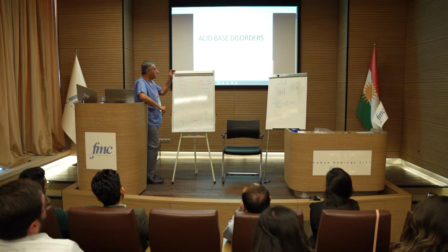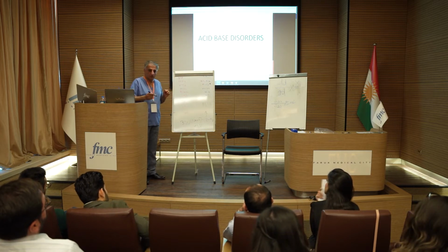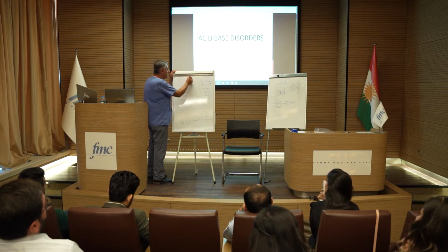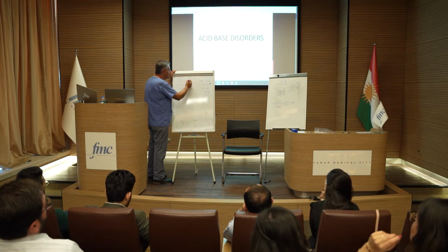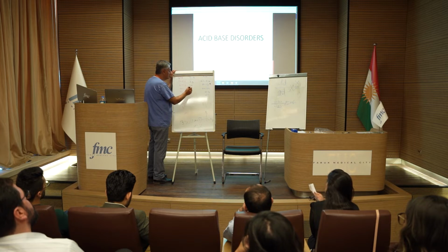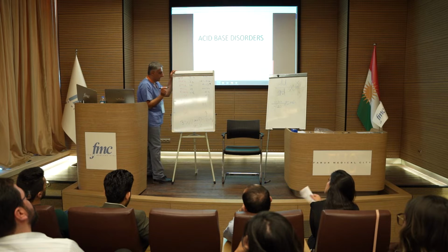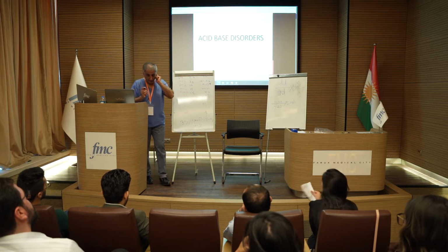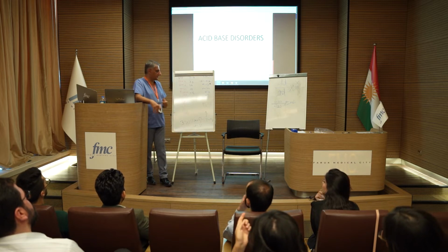Now, I'll go with a scenario and then ask you to interpret it. The patient's pH is 7.2, PCO2 3.3, PO2 14 on 2 liters, HCO3 15, base -8. Now, if I ask you to analyze this, what do you think?